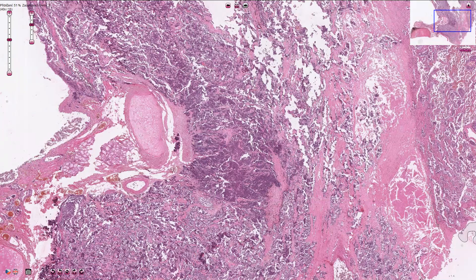Small cell carcinoma of the lung is a poorly differentiated neuroendocrine carcinoma. It consists of relatively small cells with round oval shaped nuclei with minimal cytoplasm.